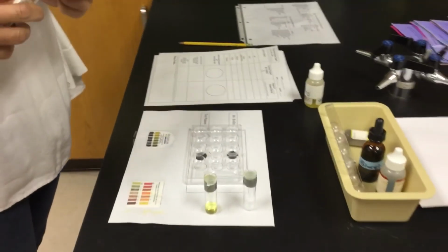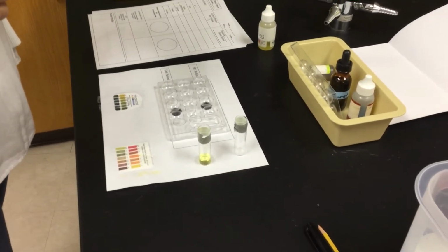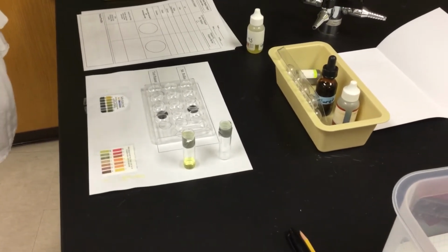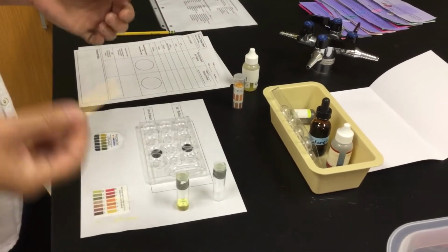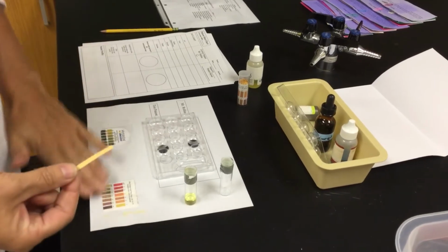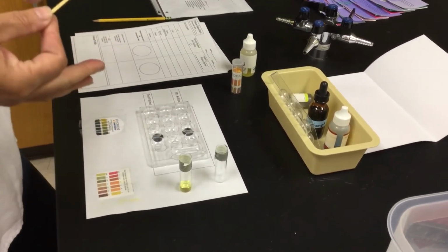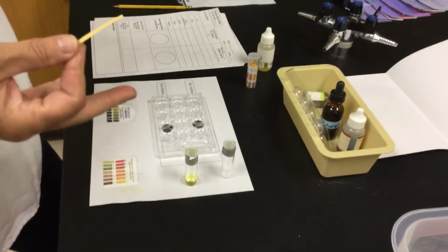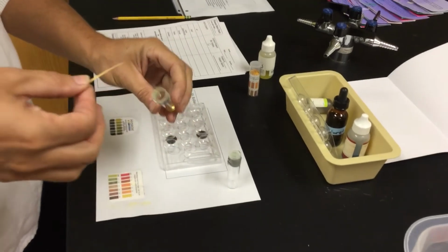We know that pH runs 0 to 14. We did it with our water. You will see it again with some basic chem stuff coming up. And the pH paper that we're using is pHydrion paper. So pHydrion paper is this orange paper. You'll dip it in. It should change color. Now, urine should be around that 7-ish. It's probably a little bit more acidic, 6-ish range, but anything from about 5 to 8 is what you're going to end up seeing here.